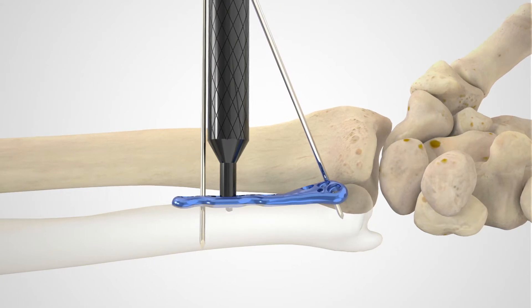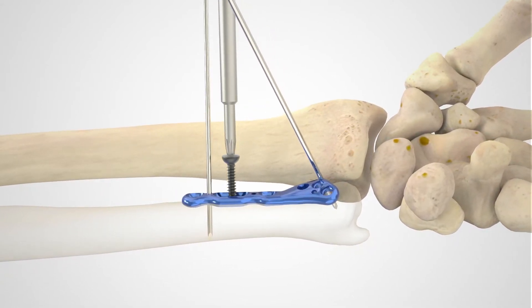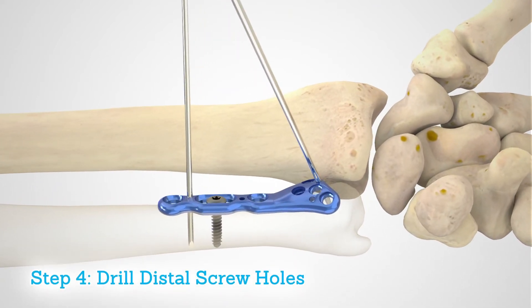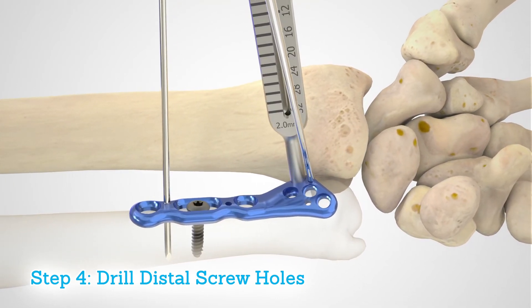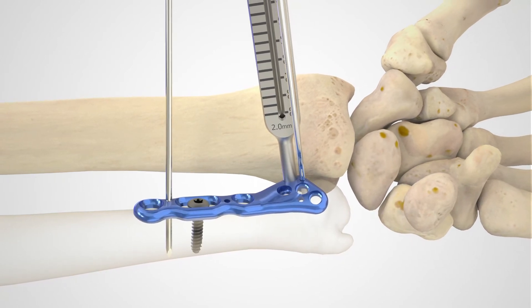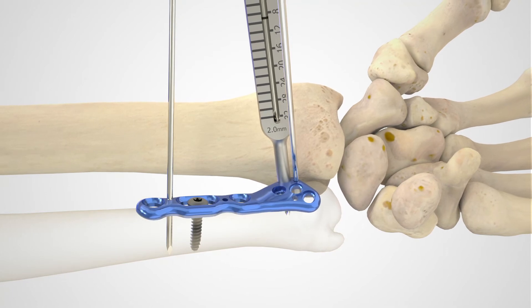This will be the same drill used for the distal screws of the plate. Measure the drill depth using either the laser line on the 2.0 millimeter quick release drill or with a depth gauge, and then insert the appropriate length screw. Drill the first distal screw hole using the 2.0 millimeter quick release drill and the 2.0 millimeter locking drill guide, keeping in mind the articulating surface past the far cortex.